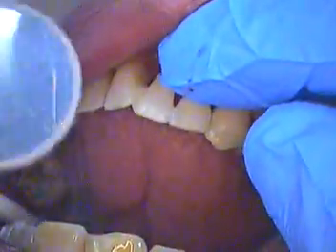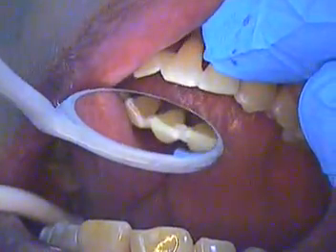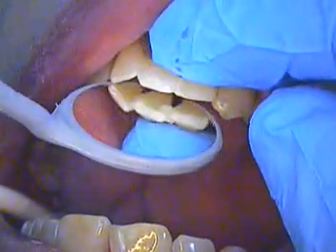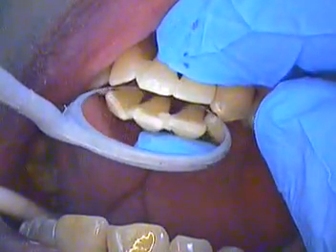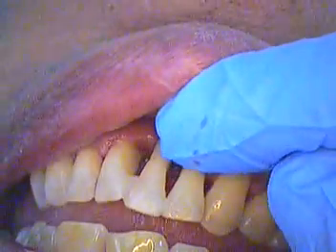Open, please. That's nice. So we're going to put the rubber dam on now. Do you need another break at all? No? You're good? I'm just going to go offline here, get the rubber dam in place, and then once we do that, we'll set you up in a more upright position. We'll see you on the next clip.